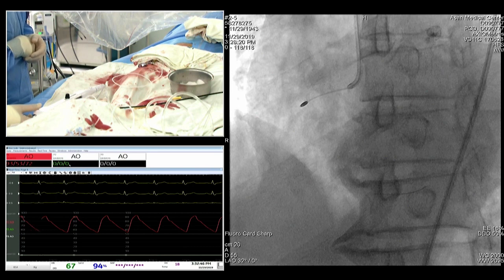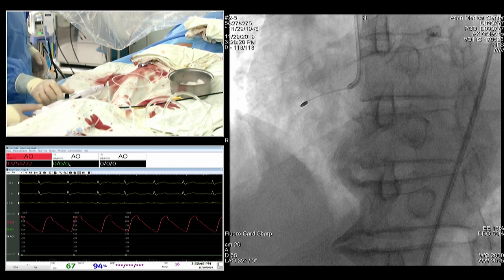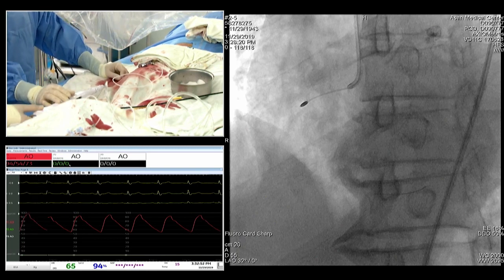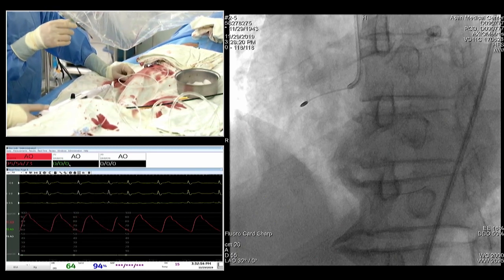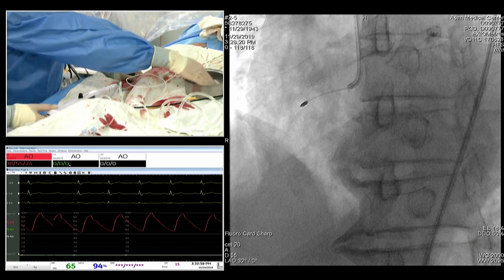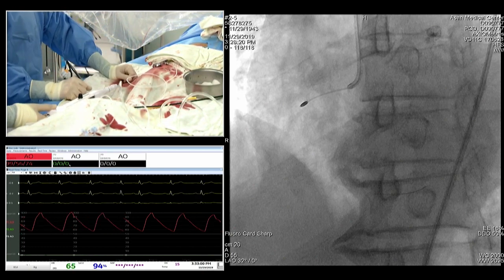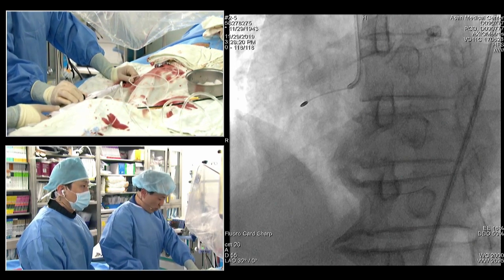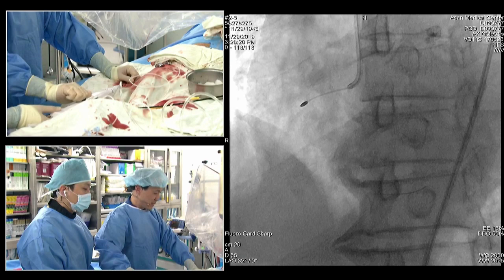So, Dr. Lee, do you inject some contrast before each pass or not? Yes and no. In my experience, giving contrast improves capillary flow, and so it reduces the risk of possible no-reflow. But whenever I give contrast, the wire gets very sticky and it gets hard to take out. So I've avoided that in my experience.